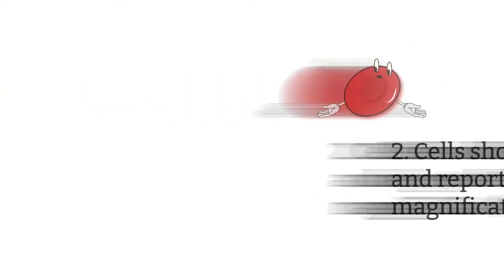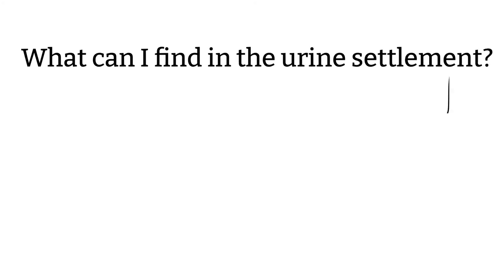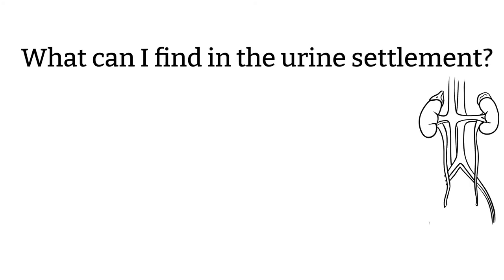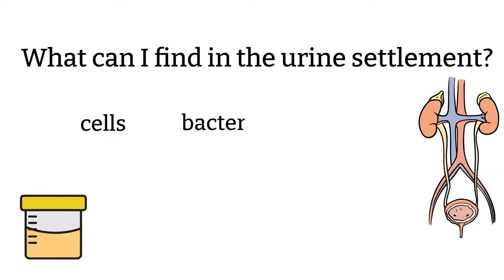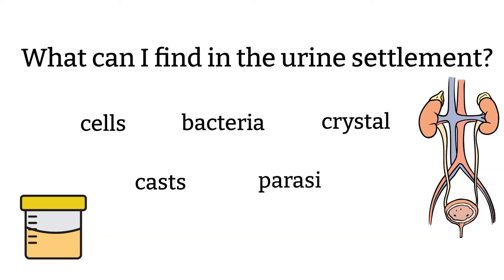What are the possible treasures that you can find? As much as I would like to mention every single possible structure you may see in urine sediment, I cannot. I will group them into cells, bacteria, crystals, casts, parasites, miscellaneous, and artifacts.